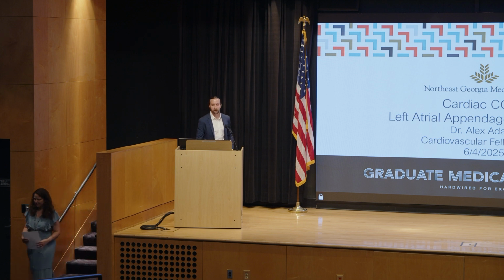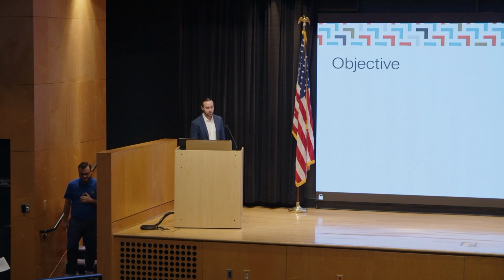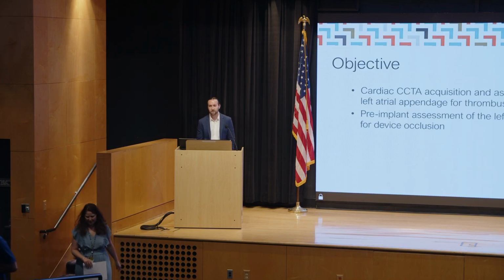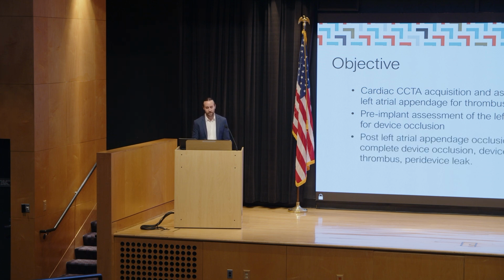Okay, so today we're going to be talking about cardiac CT, the role and assessment for left atrial appendage. The objectives of the talk today are to talk about cardiac CT acquisition assessment of the left atrial appendage, predominantly looking for the morphology and for thrombus evaluation. We're also going to talk about how CT looks for pre-left atrial appendage occlusion assessment, and after you put in a left atrial appendage occluder, how we assess it for complications.